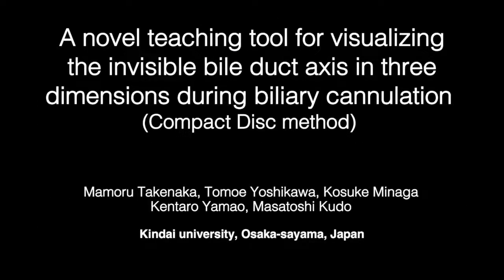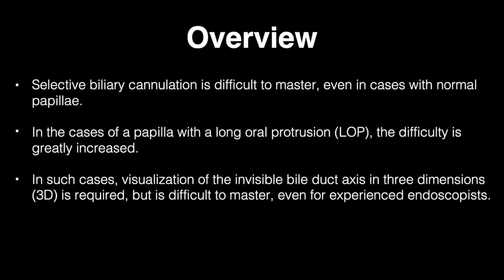A novel teaching tool for visualizing the invisible bile duct axis in 3 dimensions during biliary cannulation: the compact disc method. Selective biliary cannulation is difficult to master even in cases with normal papillae.